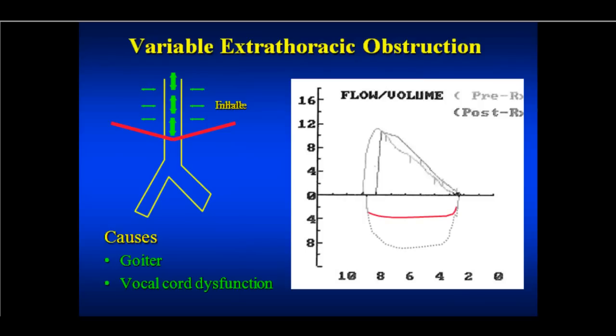All right. So let me walk through a couple more unique flow volume features, because you probably will see these on the boards. They're a favorite, and they're easy to put on there, easy money. So what I'm showing you here on the left side of the slide is this schematic of my terrible drawing. The red lines indicate the level of the clavicle. So anything below that is intrathoracic, and everything outside of that is extrathoracic. And here we have the extrathoracic trachea, and we have an intrathoracic part of the trachea going into the left here and into the right.